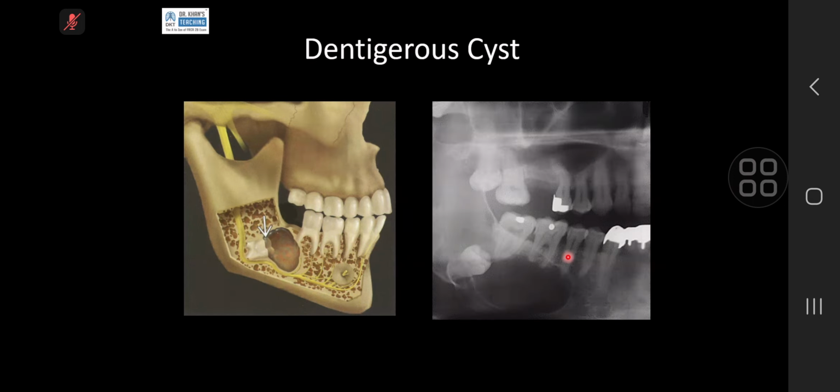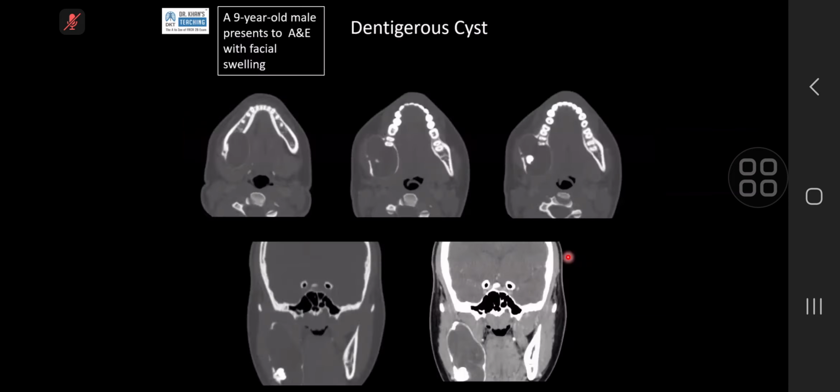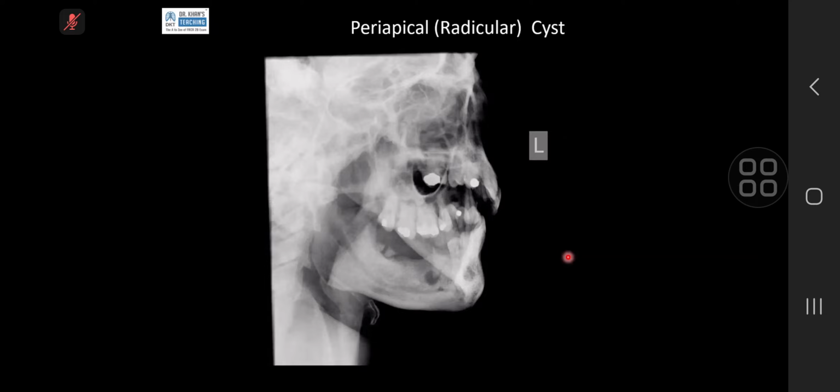Otherwise there were no teeth in our patient. Even on MR it has come in the exam, which becomes quite difficult to pick up. So dentigerous cyst can come in the exam, and the questions will be around how you differentiate and things like that.